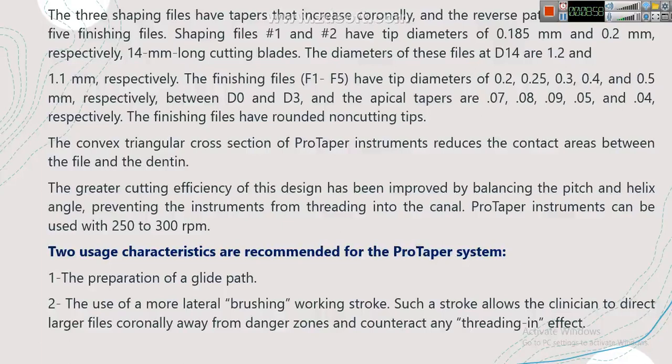The finishing files, from file 1 to file 5, have tip diameters of 0.2, 0.25, 0.3, 0.4 and 0.5 millimeters respectively.